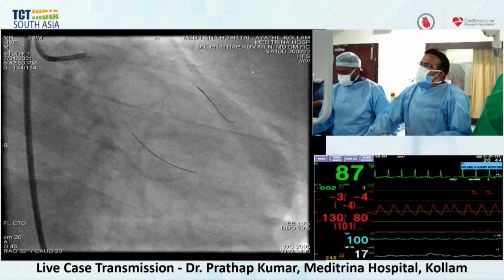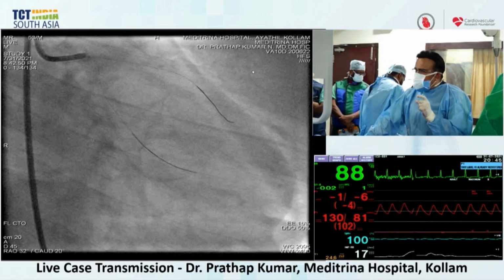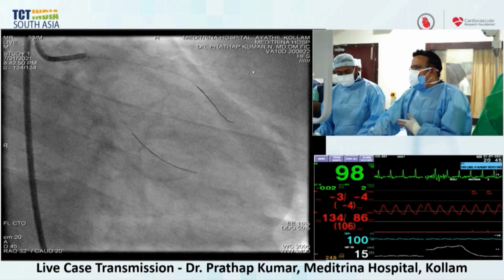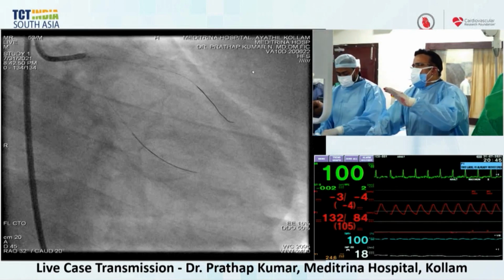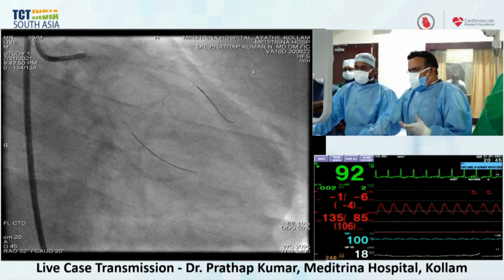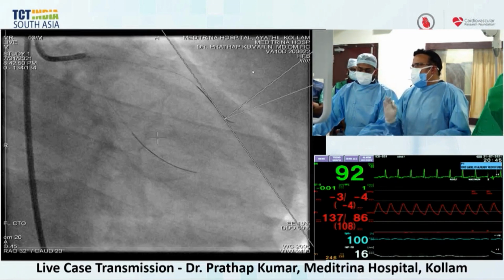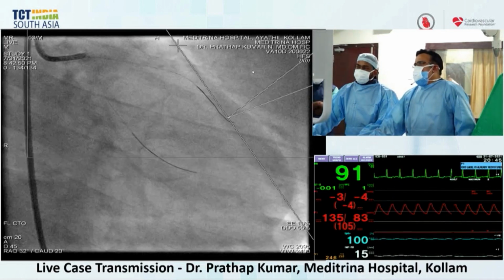Yeah, Dimitri, the only point I just wanted to stress is, if you have a vessel lumen which is underfilled, distal to the entry of the septal collaterals, then you require a wire to go antegrade. Otherwise, if the retrograde septal collateral was distal and the vessel disease was totally in the proximal part of the collateral, that is RG3, then we usually finish everything with one wire and we don't take another wire here. And naturally, in this case, we definitely require a wire in the circumflex. Do you agree with that? Correct?